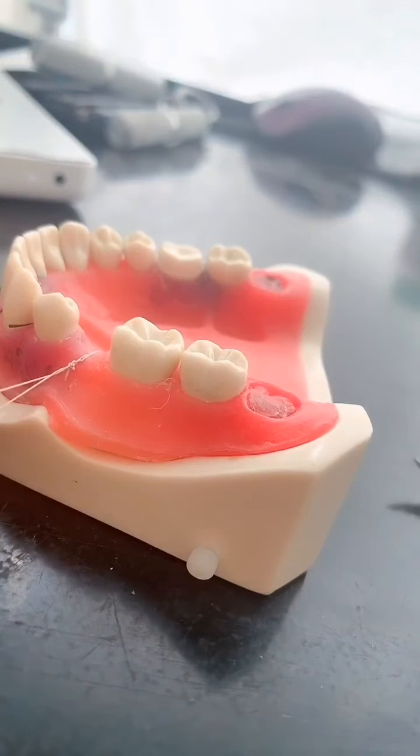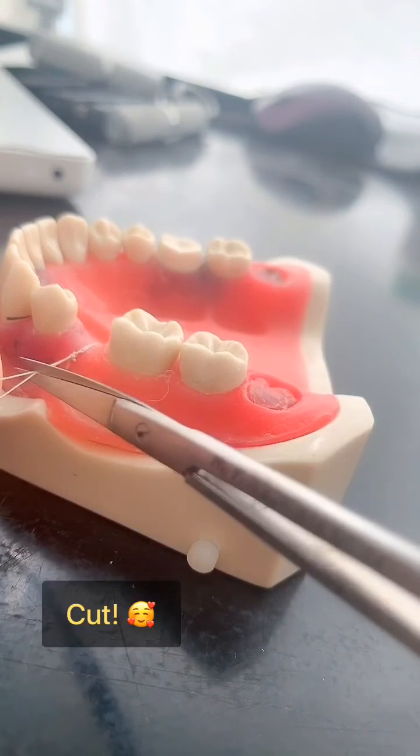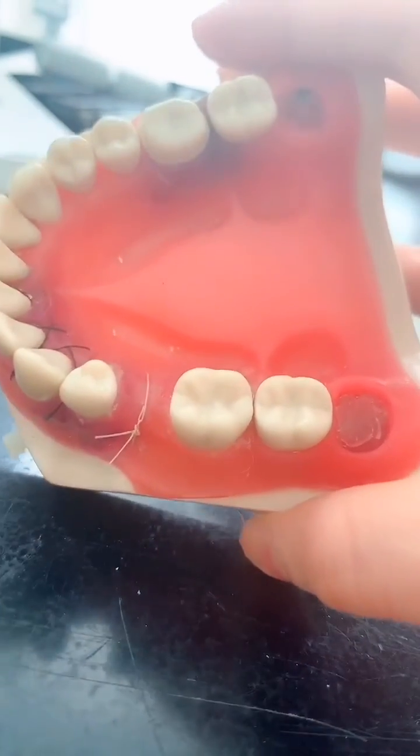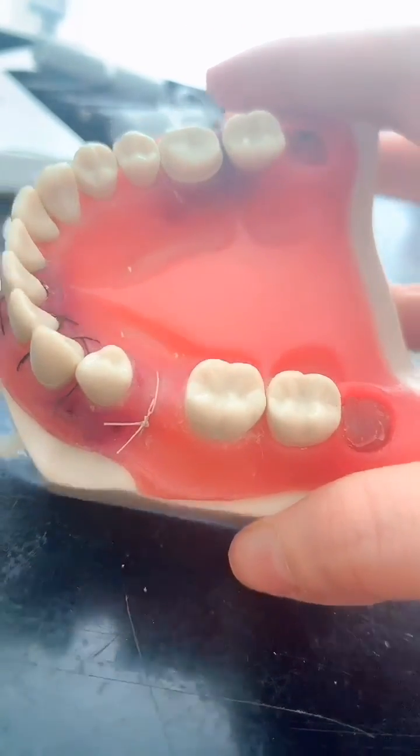And then you cut — most satisfying part, just cutting the suture's top — and there you have it: a nice closure for your GTR procedure.